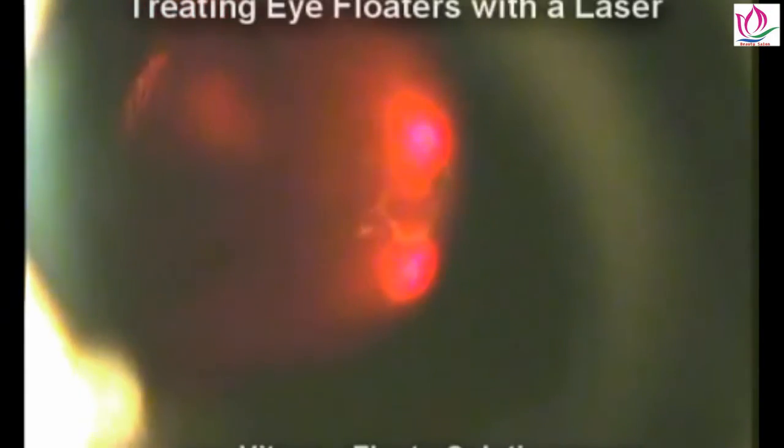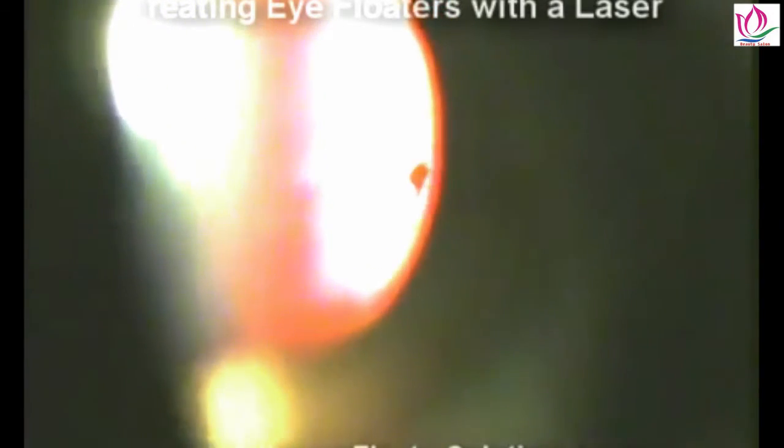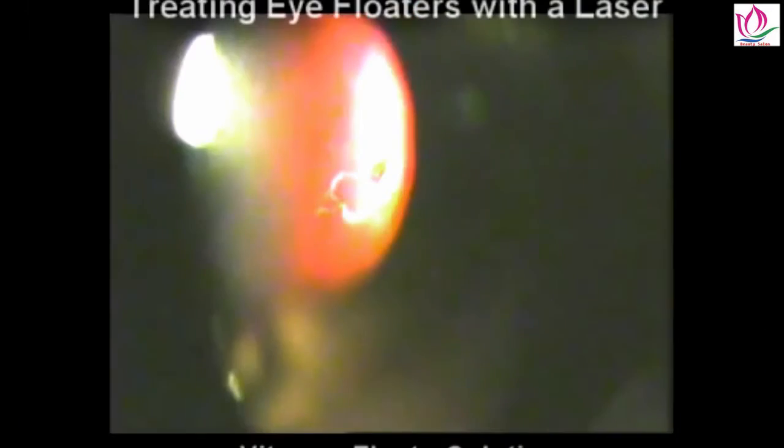So again, we kind of move the eye a little bit, move my light source back and forth. And you can see that this ring does not float freely around as if it were in clear water. It remains somewhat suspended in the same position with a little bit of movement. And I apologize for the video quality. My view is always much, much better than this. And there's a freeze frame of it showing it frozen in place there.